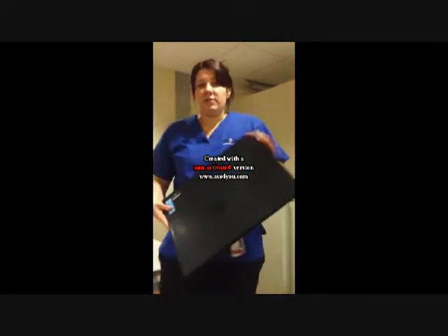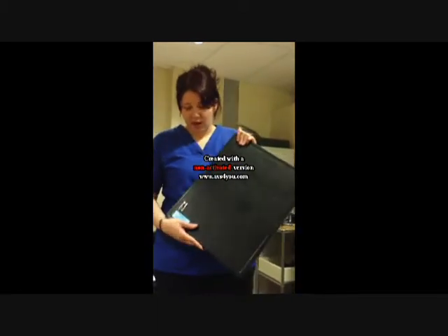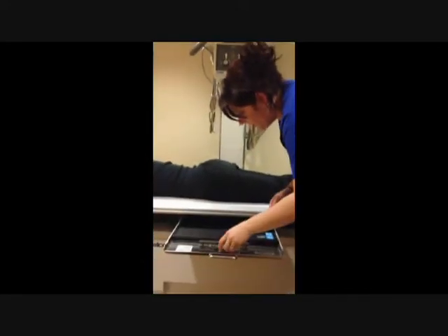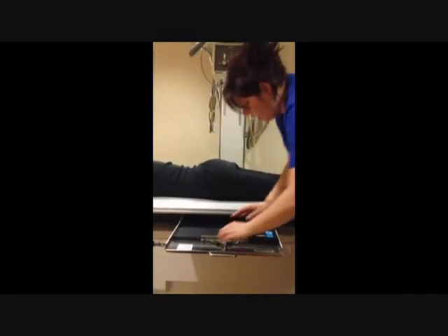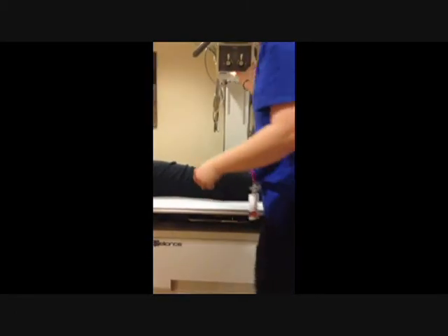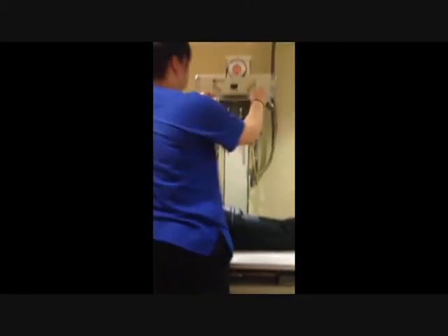We're going to, again, use a 14 by 17 lengthwise. I went ahead and put my marker down by the ID blocker. We're going to put it in so that it's lengthwise, ID blocker down. And it's her left side because she's laying down this time on her stomach instead of on her back. We want to make sure that this is in transverse detent.